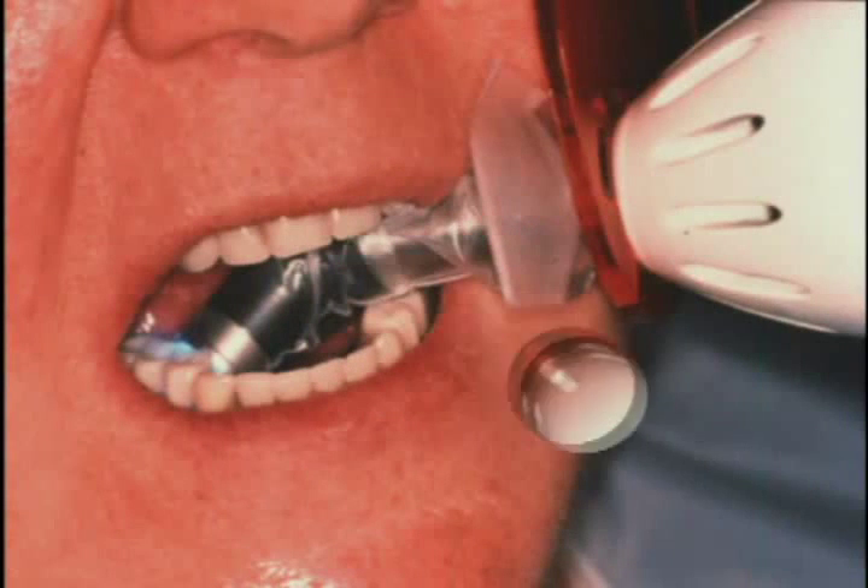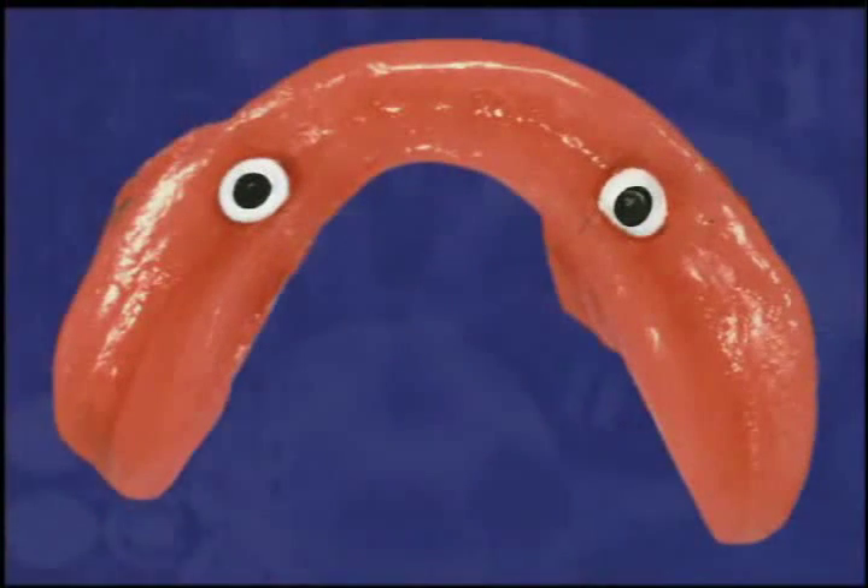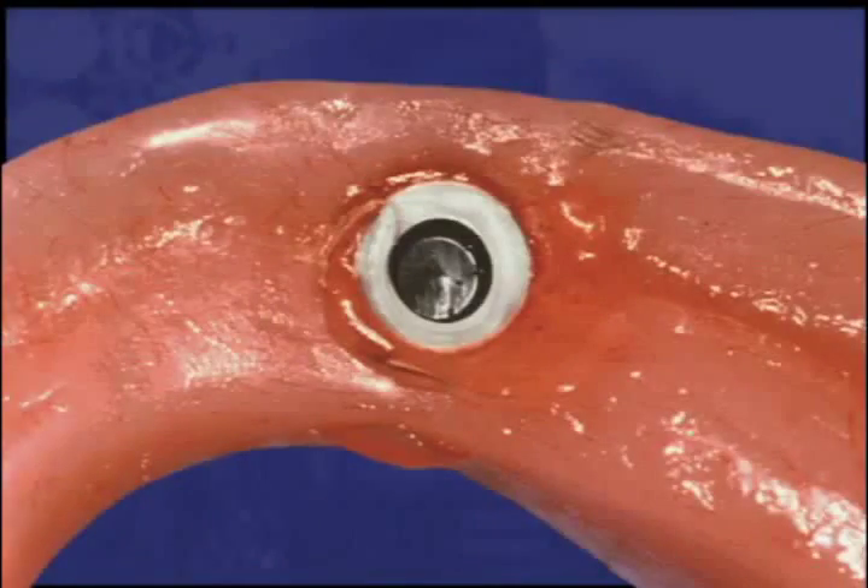The denture was inserted into position in the oral cavity, maintaining the denture in a passive condition without compression of the soft tissue, while curing with the light. An additional brief curing time on the lingual side of the denture assures fixation of the locator male into the denture base. The white blockout spacers remained in place when the denture was removed and are easily removed with an explorer instrument. Use a bur to remove excess acrylic and polish the denture base before changing to the final nylon male.